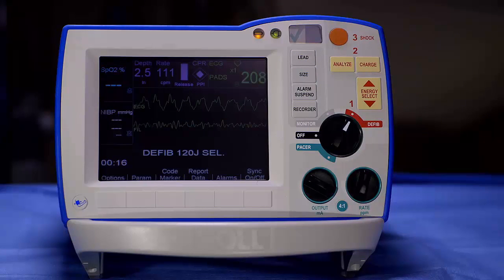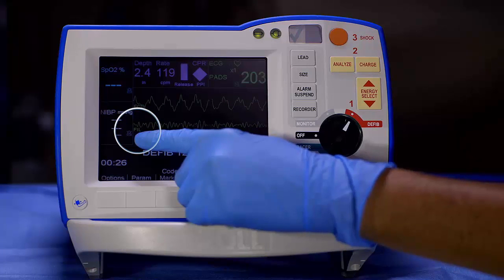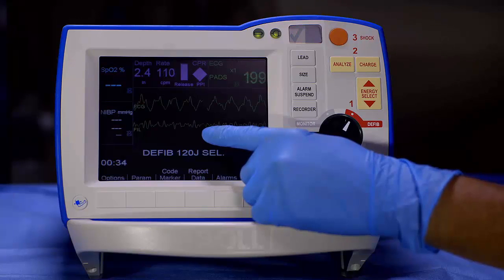The see-through CPR feature of the R-Series filters compression artifact from the ECG waveform. This results in a filtered ECG waveform labeled as FIL. This allows you to view underlying rhythms without the need to interrupt compressions. However, it is not intended to replace assessment and it does not work in the advisory mode.